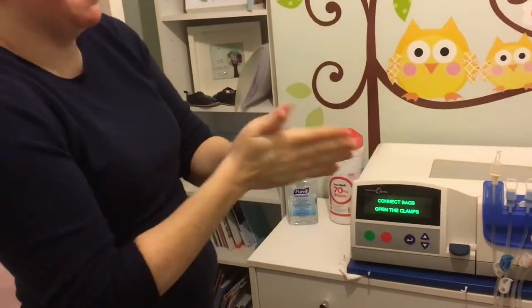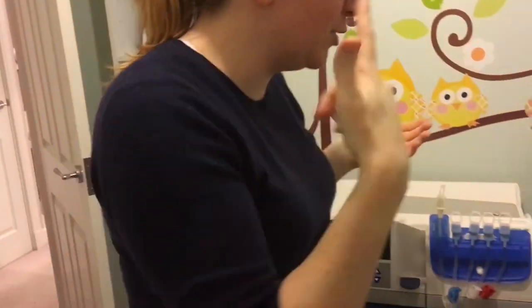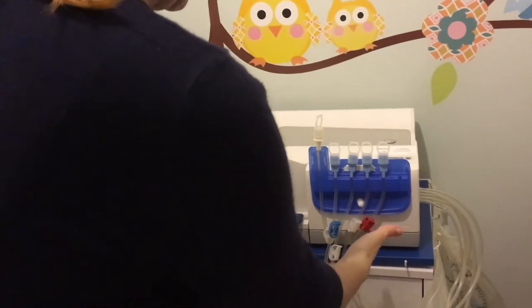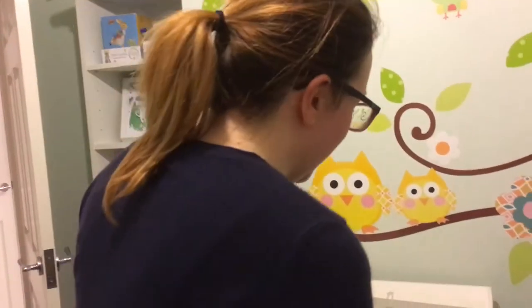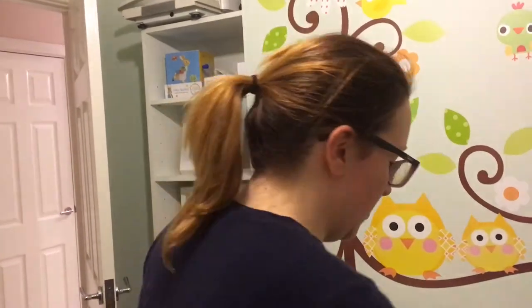Connect the bags, open the clamps. So this red clamp is going to go first — that is the bag that's going to go on the heater, so red hot. I'm not going to talk while I take the tops off because there is an infection risk, so we're not going to talk much and touch the bag.